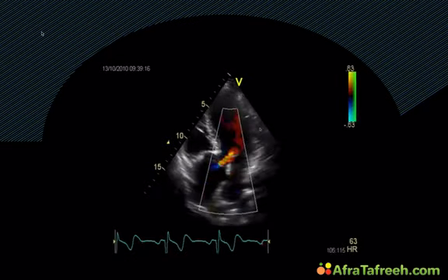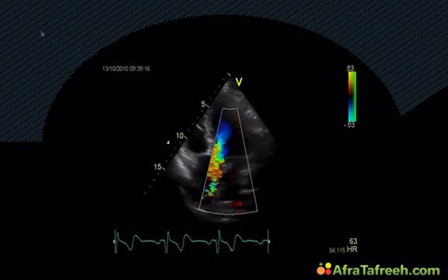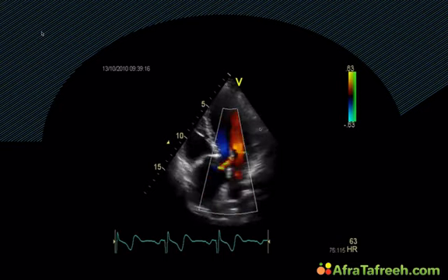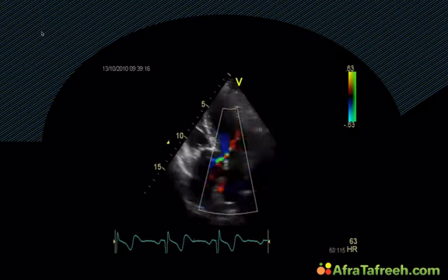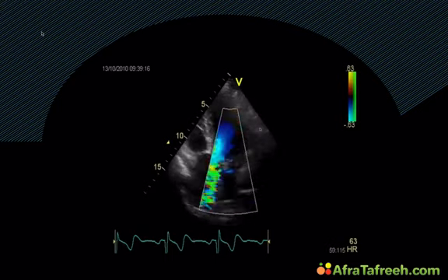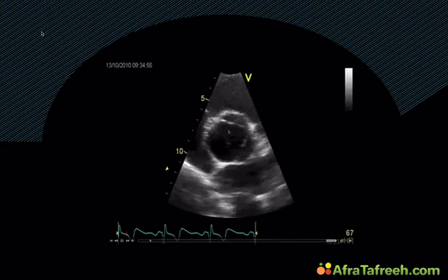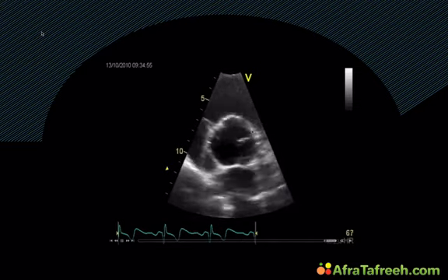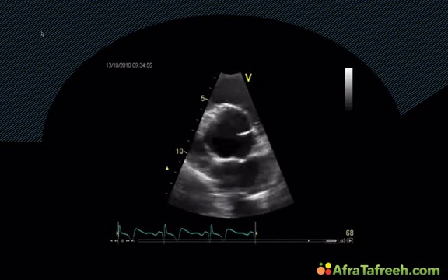This is the 5-chamber view, and what you see here is some degree of aortic regurgitation. Okay? I just got a question in from Philip, and he asked if this could maybe be a bicuspid valve with a raphe. Well, actually, no, because if we go back to this image, you can see that the separation between the cusps is complete between all 3 cusps. But you're right, it's sometimes very difficult to tell if a valve is bicuspid with a raphe or if it is truly bicuspid or tricuspid.